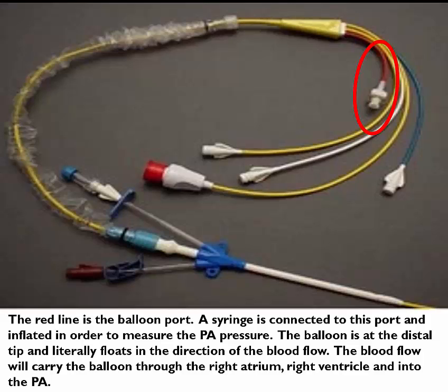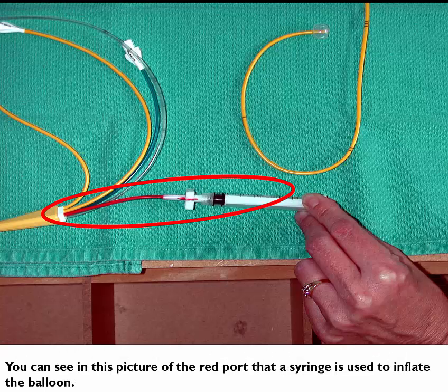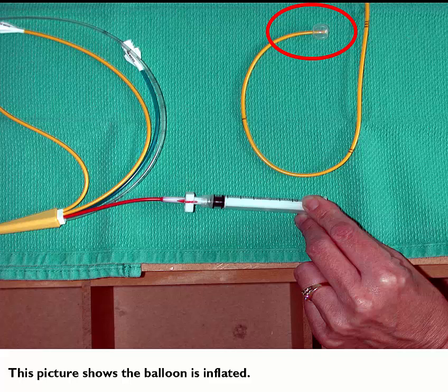A syringe is connected to this port and inflated in order to measure the pulmonary artery pressure. The balloon is at the distal tip and literally floats in the direction of the blood flow. The blood flow will carry the balloon through the right atrium, right ventricle, and into the pulmonary artery. You can see in this picture of the red port that the syringe is used to inflate the balloon. And this picture shows the balloon is inflated.